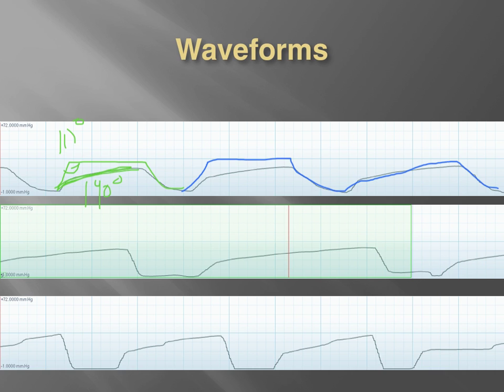Now the other side of the coin to look at here is, we mentioned before that this line right here is about 35 millimeters of mercury. Okay, her waveform height is actually pretty normal, which probably means her end tidal is relatively normal as well. However, she's breathing much faster. Look at her respiratory rate. Okay, it's a little bit faster than what it should be, and even though we have this bronchoconstriction, we'll just call it, or delayed exhalation, her end tidal level is actually relatively normal.